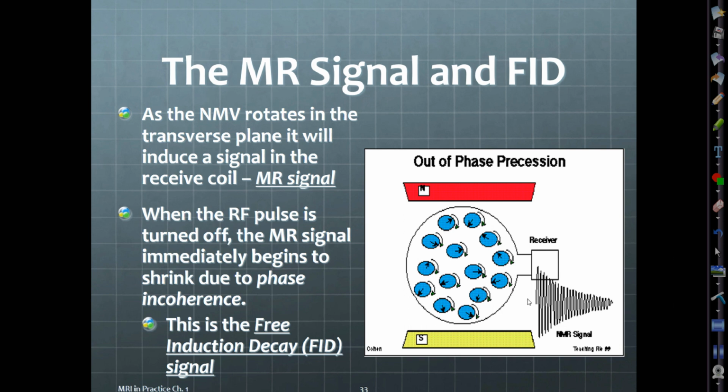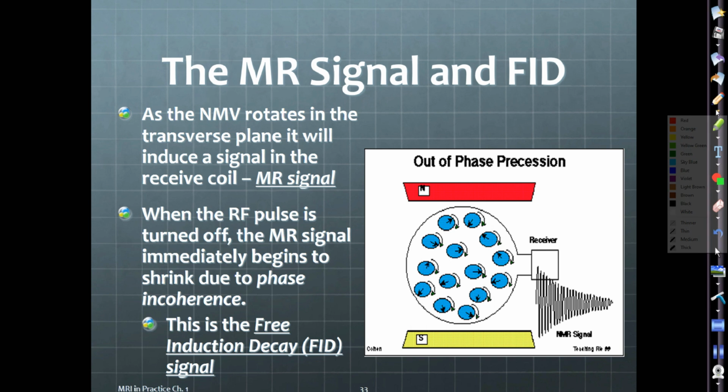You can see how we had that receiving coil, and we were getting good signal, but the moment we turned it off, if you draw a slope on top of this right here, our signal starts to decay rapidly. Okay? And this is described as the free induction decay. And its acronym is FID. So make sure you know this concept, FID.